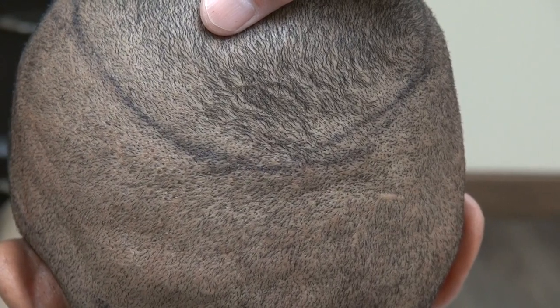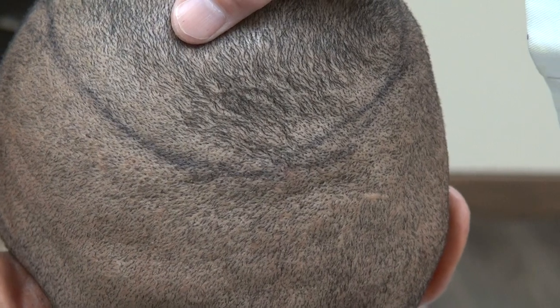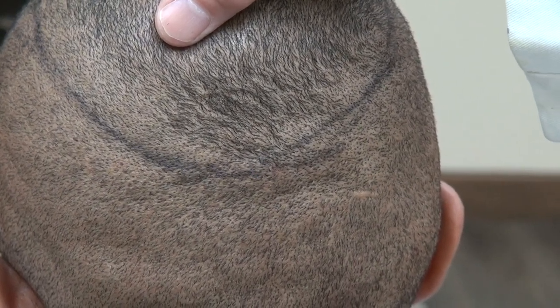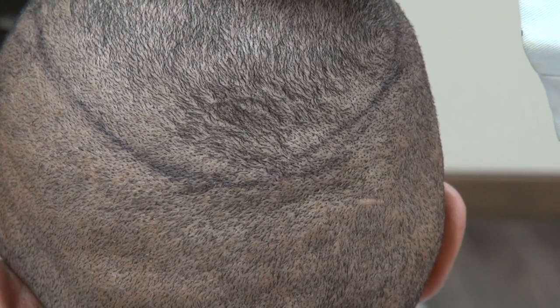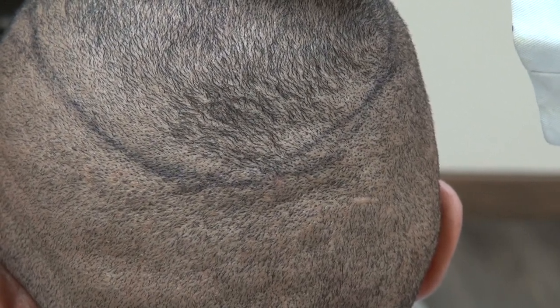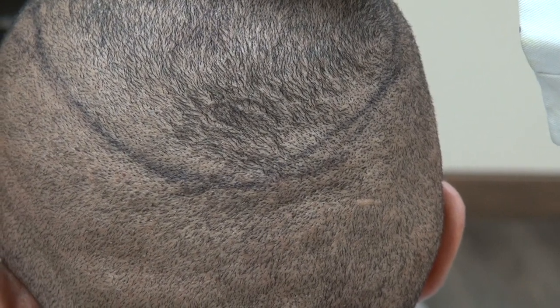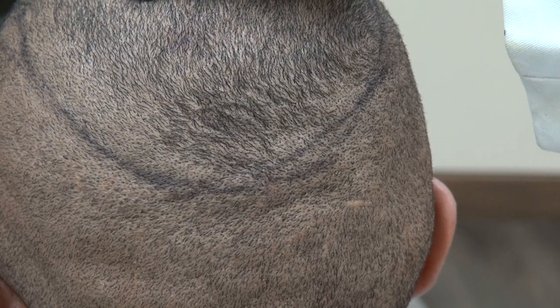This video is a demonstration of FUE donor scar harvest using a tip size of 1.0 millimeter. Online advertisers promote tip sizes of 0.7 and 0.8 millimeter, but what is the use if those smaller tips destroy all the roots and produce horrible results? You pay for results, so the outcome is what matters.